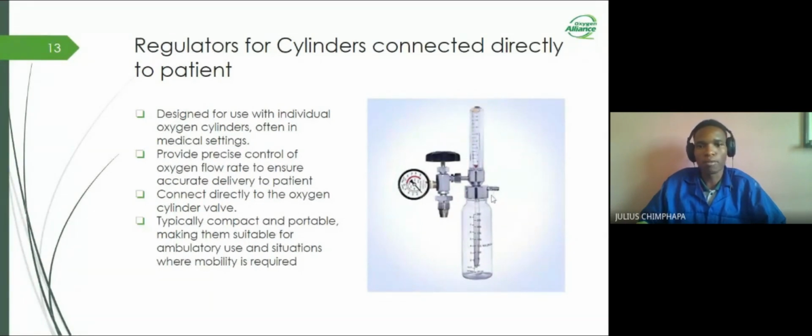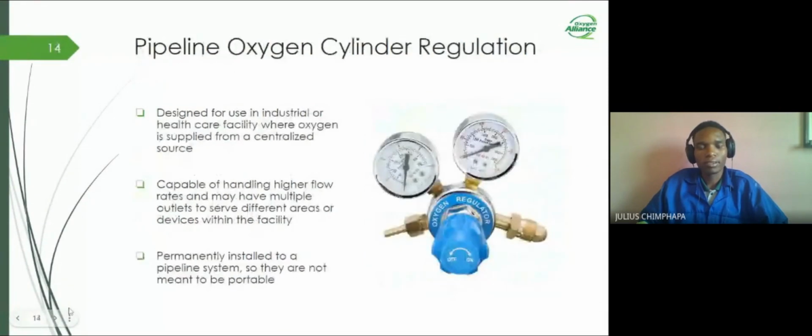These ones are portable, so they can be taken wherever you want to use them, which is not the case with the regulators for the oxygen pipeline system. So moving on, the pipeline oxygen regulation uses this kind of regulator shown on the picture.